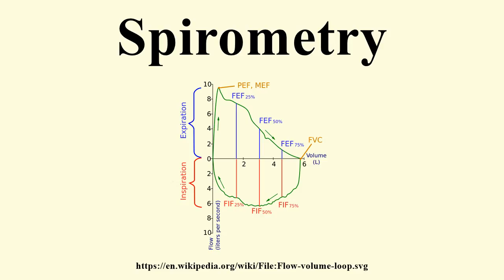Average values for FEV1 in healthy people depend mainly on sex and age, according to the diagram at left. Values of between 80% and 120% of the average value are considered normal. Predicted normal values for FEV1 can be calculated online and depend on age, sex, height, mass and ethnicity, as well as the research study that they are based on.